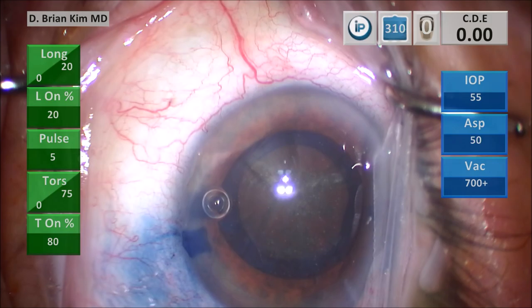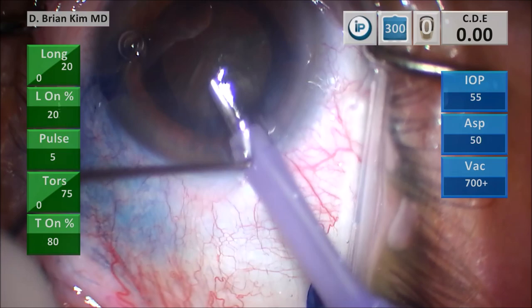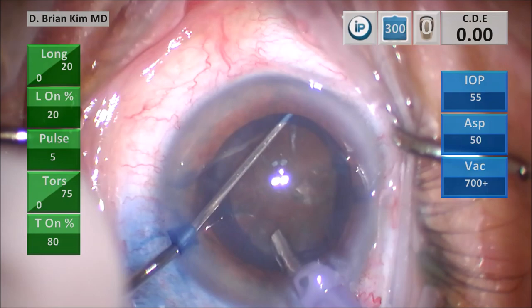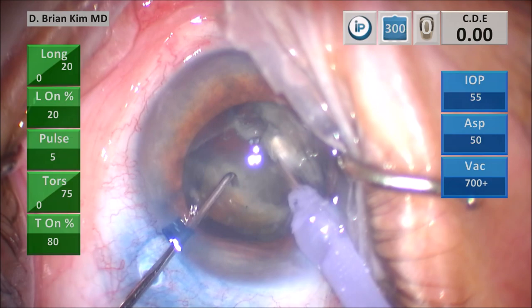I'm irrigating the surface of the eye, making sure my sleeve is in the proper position. I'll lift the incision with the chopper, go in with irrigation off to minimize Descemet's trauma. You can see how much I've exposed the tip with this very dense lens. I place the chopper out to the equator, point the tip vertically sub-incisionally, bringing both instruments together very slowly. You can see the whitening of the lens — I crushed the lens completely in half, using no vacuum or ultrasonic energy. I was able to propagate the chop all the way through.